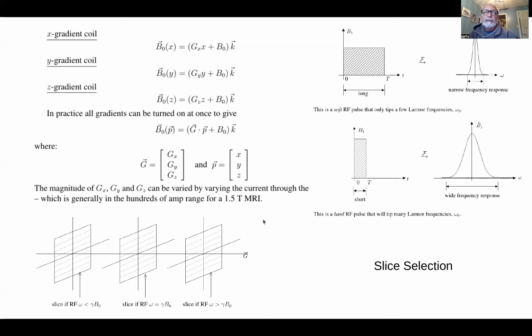Essentially, for the pulse sequences that we just looked at, the basic spin echo pulse sequence, you can assume soft RF pulses as you go. That'll give us some nice narrow slices, and we can be sure that all the excitations that we're doing happen only on that particular slice.